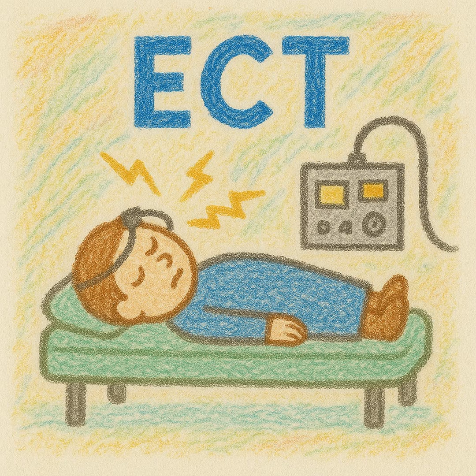Once they're awake and talking, you take off all the leads, and then they get wheeled back over to the PACU to recover, because they're going to be a little bit groggy, and we want to just make sure their vitals are fine for a while and stable before the discharge, and get the IV removed and all of that.